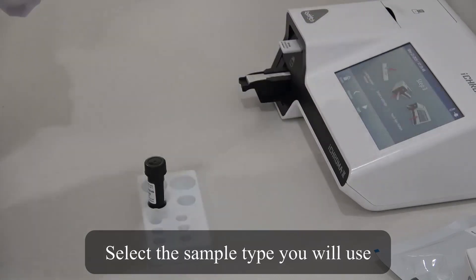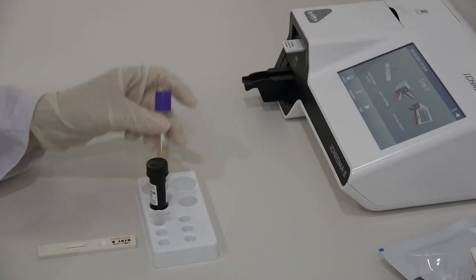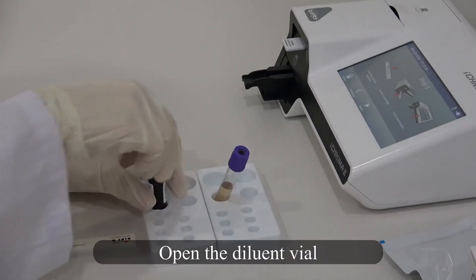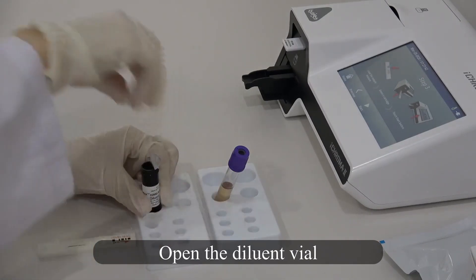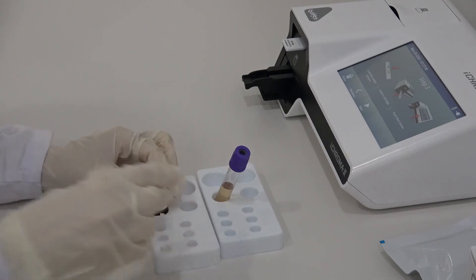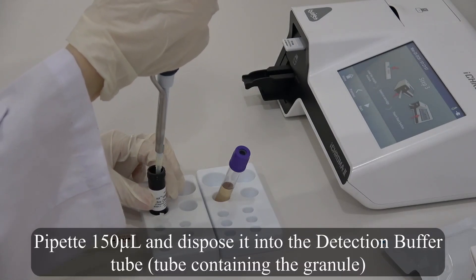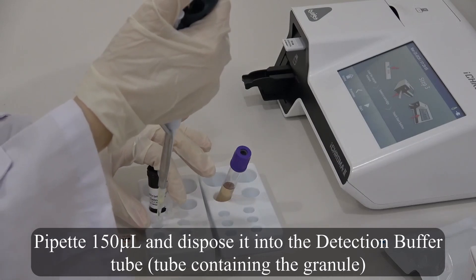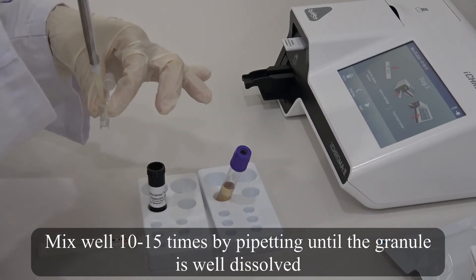Select the sample type you will use. Open the diluent vial. Pipette 150 microliters and dispose it into the detection buffer tube — the tube containing the granule. Mix well 10–15 times by pipetting until the granule is well dissolved.